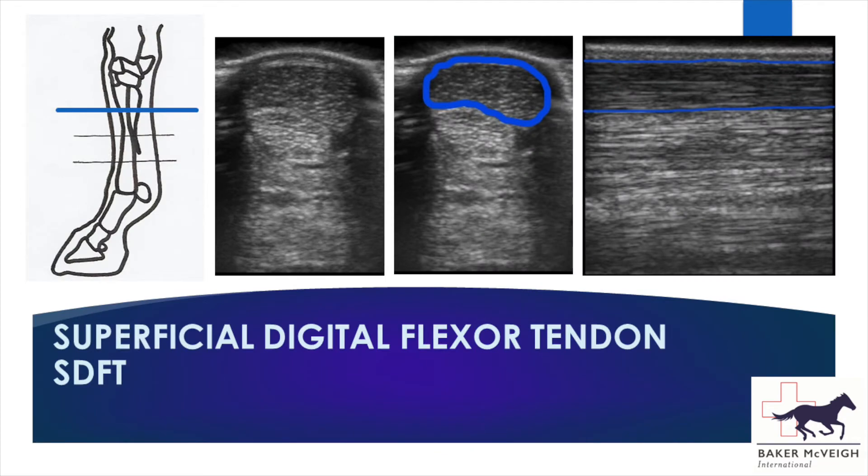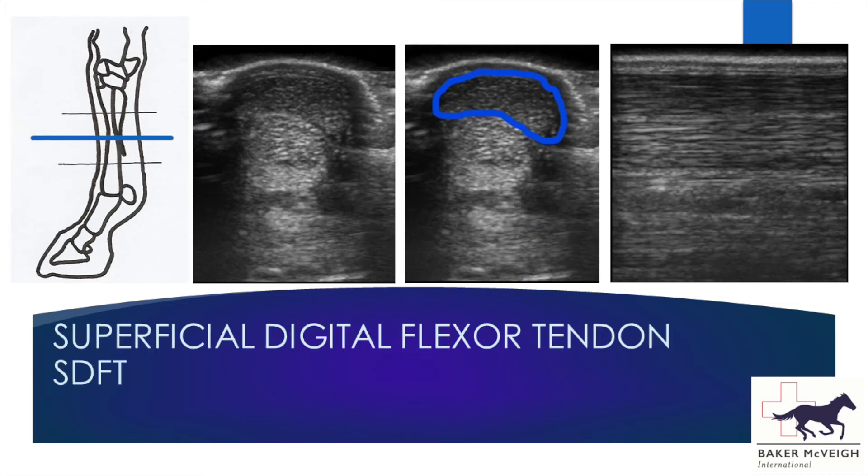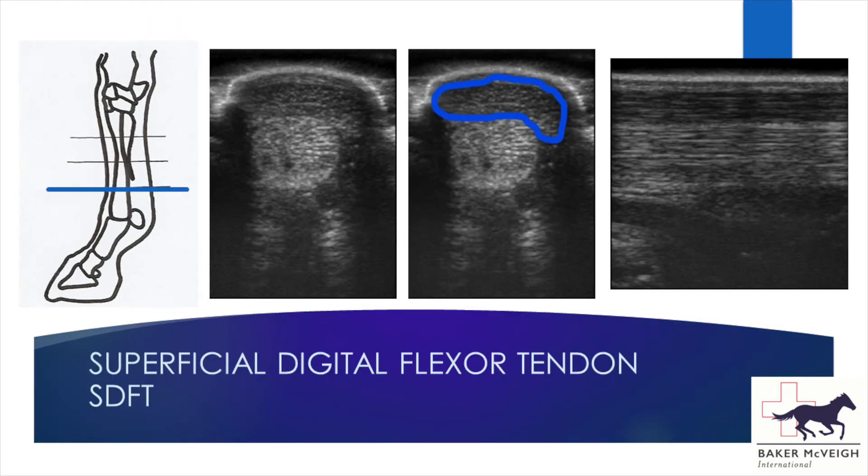The superficial digital flexor tendon is the most common tendon in which we find injuries, giving that typical bowed tendon appearance — because it lies straight under the skin, any swelling is the most visible. As we go down the leg the tendon becomes slightly thinner and flatter, wrapping around the deep digital flexor tendon. On the transverse image you'll see the speckled appearance of each tendon, which results from the subdivision of each tendon into bundles of fibres surrounded by connective tissue, causing low levels of reflection of the ultrasound waves.